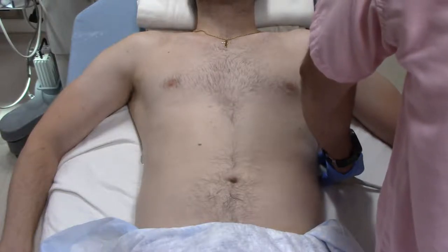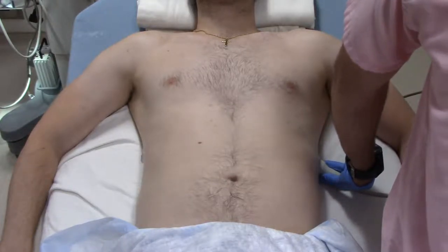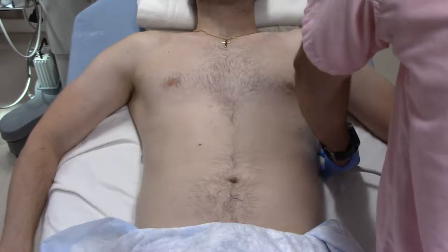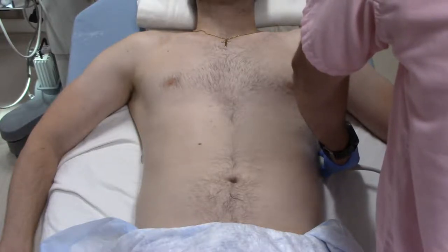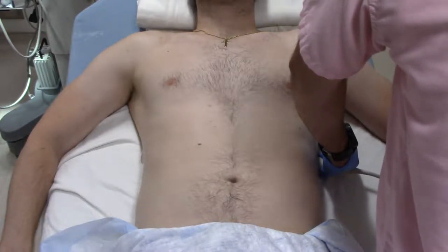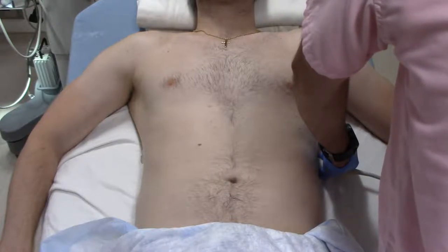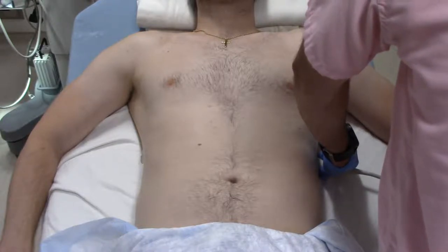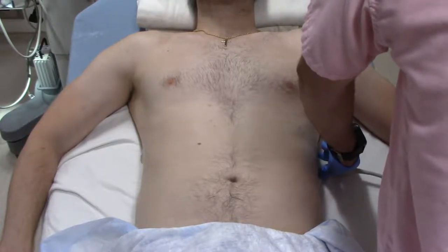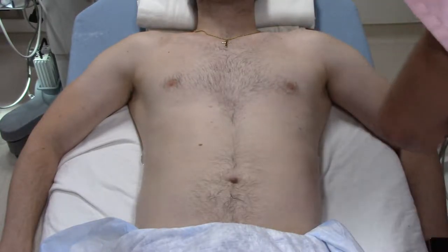Now we're going to tilt up towards the patient's head, angling that way so that we can see up through the spleen into the diaphragm, using our spleen as our acoustic window. We're seeing that bright white line and looking for black behind it, fanning the back of the hand just a little bit to make sure there's no black behind that.